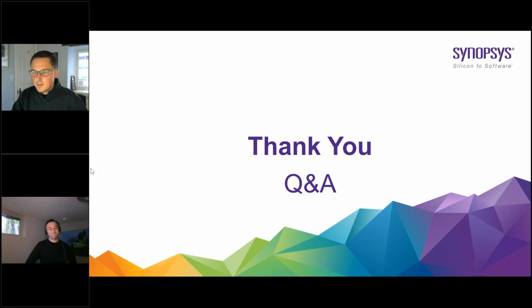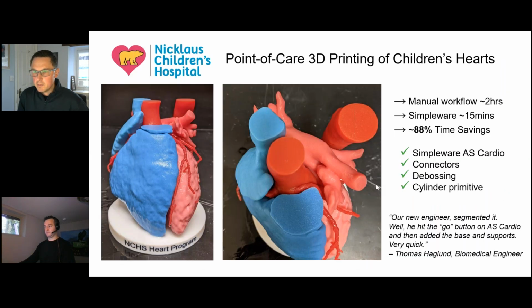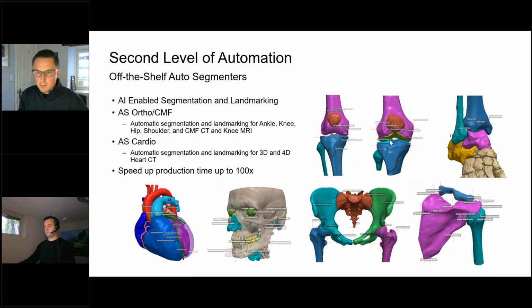Yeah. Good. Thanks, Karim. Is the MRI relaxometry for T2 mapping of the cartilage available within the software? Yes. I'll try and answer it high level. The MRI knee has a T2, T1, and PD weighted scan capability, so it will be set up to extract cartilage on the tibia and femur as shown right there. Thank you. Best bet is just to try it, you'll get an answer pretty quickly with the free trial.